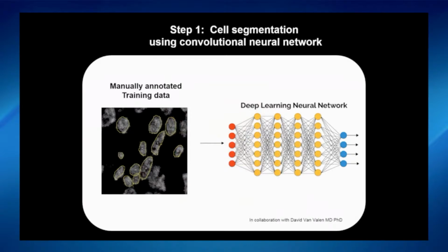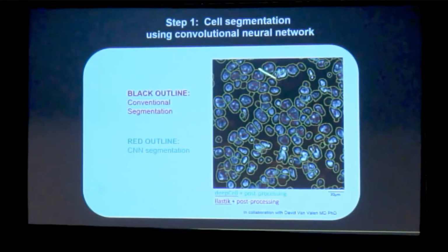And what we found was this actually, and most of this, the platform that we utilized was something called DeepCell, which was developed by David Van Valen. He's new faculty at Caltech, and to his credit, we really didn't do very much to alter this platform he had already come up with. We put in the data, and the results that we got out were actually much better than anything we were able to achieve with all the other typical segmentation platforms out there.